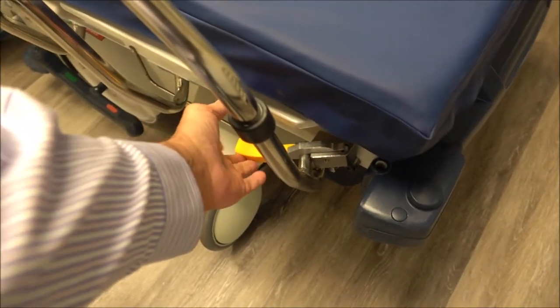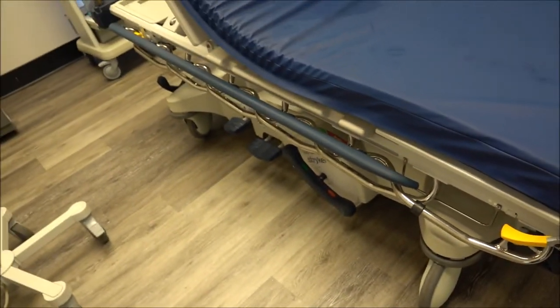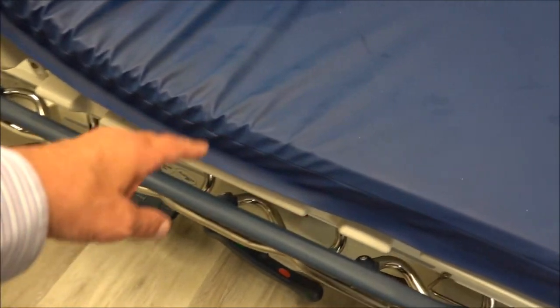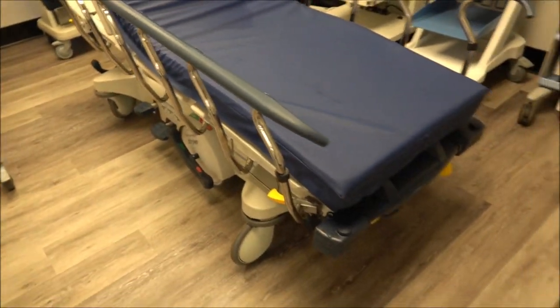With one hand, I can easily just drop the rail down. When the rail goes down, it drops below the patient, so it's never going to be in the way when the person is getting off the stretcher. The rail will never get in the way. And you can see — very, very easy to put that back up.